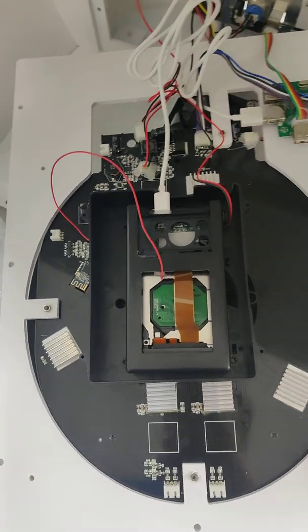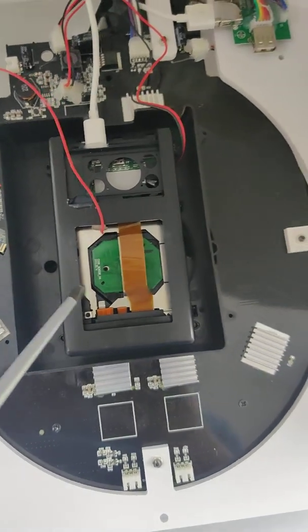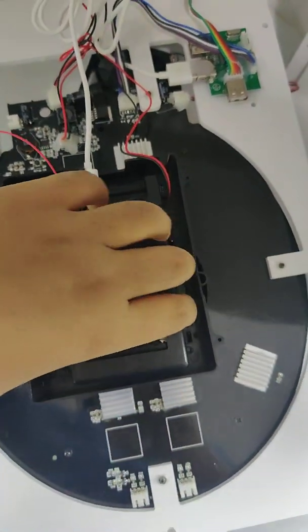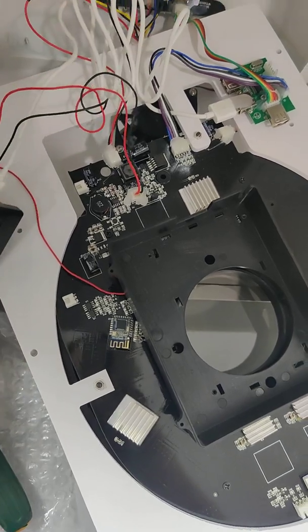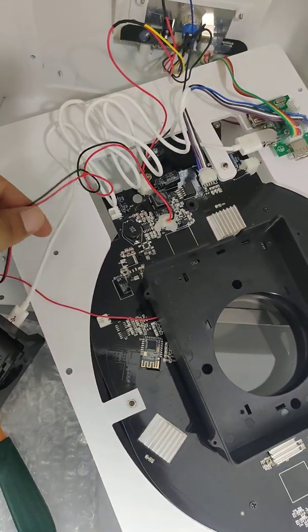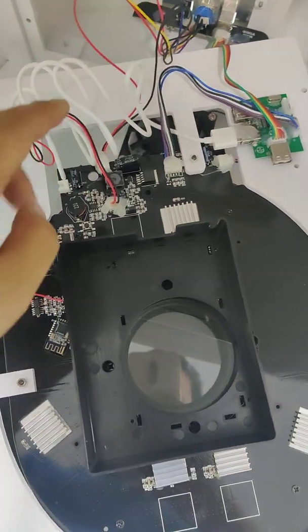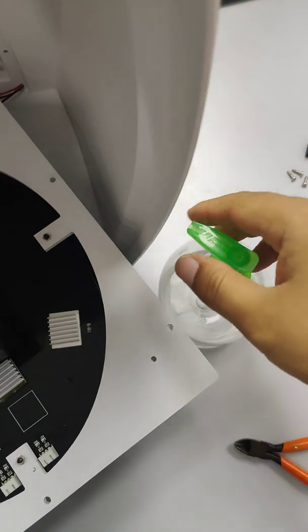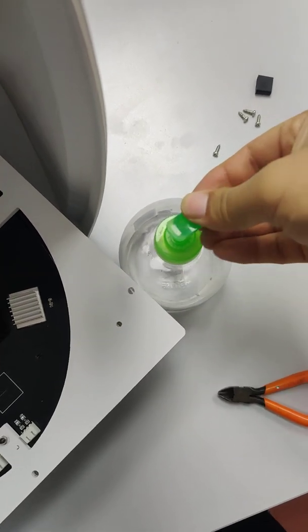Okay. Then we need to take off this screw, and this screw, so we can pick up this camera. Okay. Now we can see there are 3 cables connected to the camera. This one, and this one. Okay. In order to take off these 3 cables, we need to use the alcohol here. We use some alcohol to take off the gel.